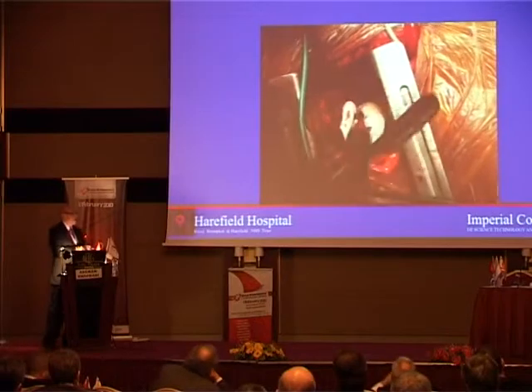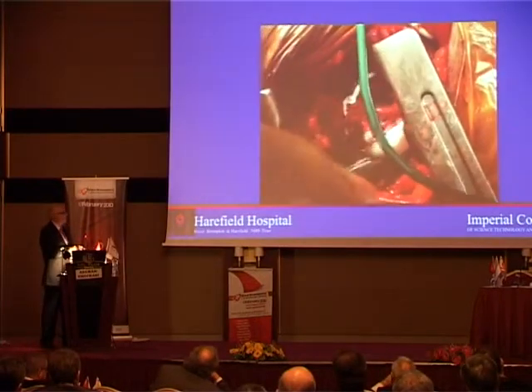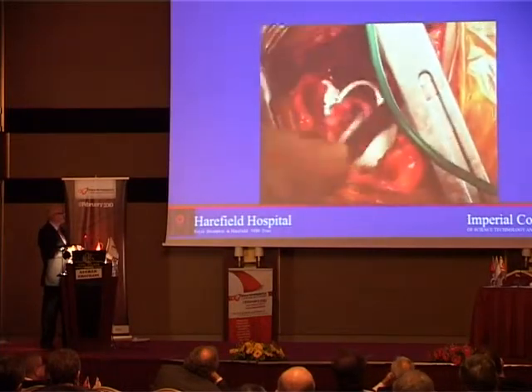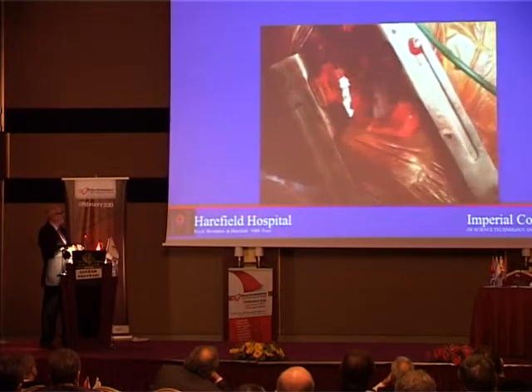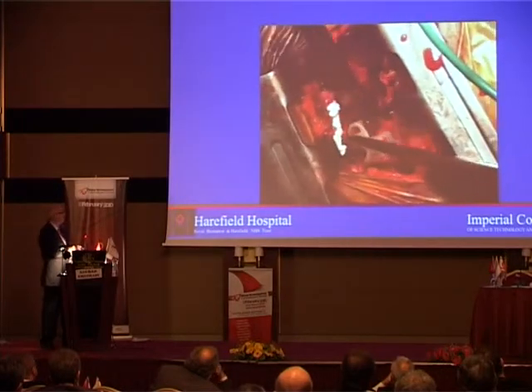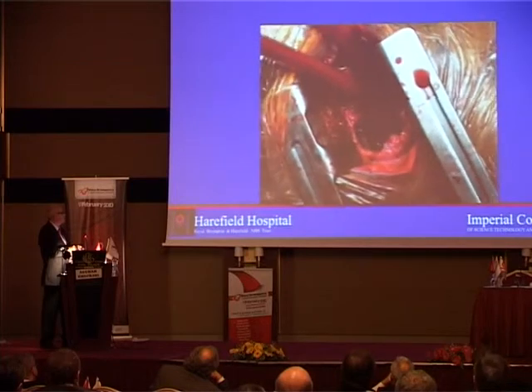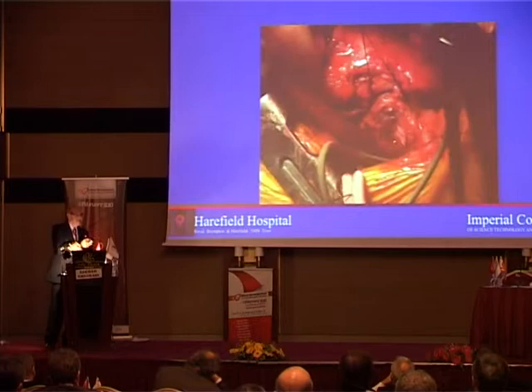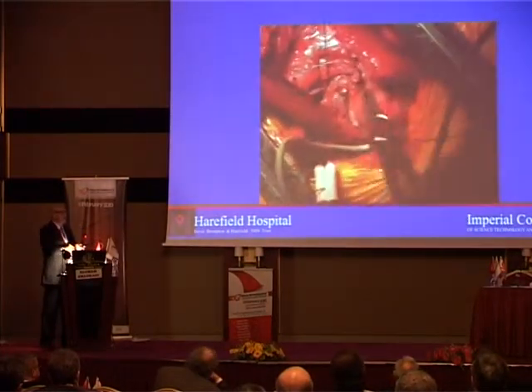These hearts are very vulnerable to damage. If the heart has recovered, you want to protect it. And to protect it, you have to do minimally invasive procedures. Just pulling the cuff out again. When this is running again, I can answer questions because most of it is shown in here.